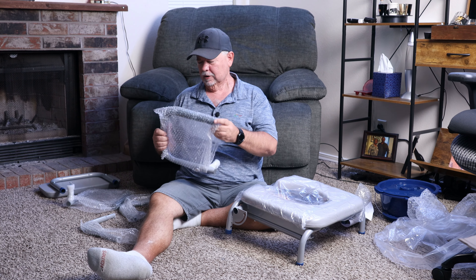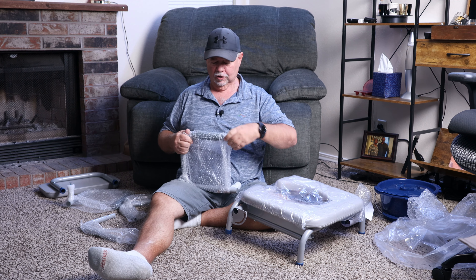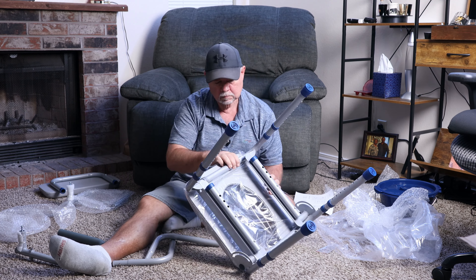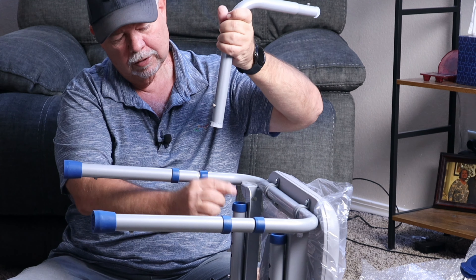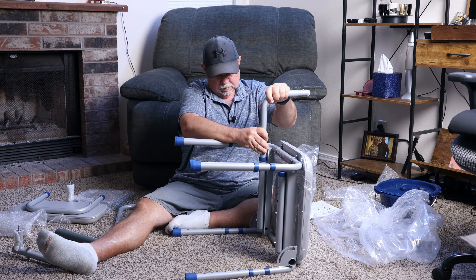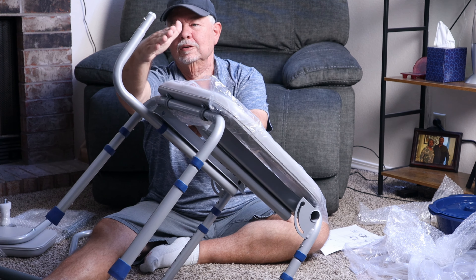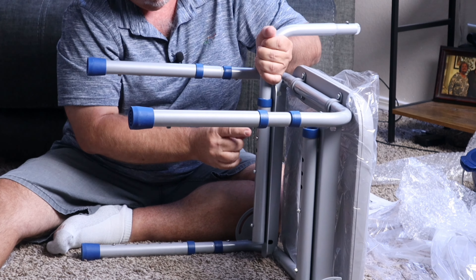Looks like we're going to build the frame. Instructions are not real clear — it's mainly just pictures. So if you're good at following picture instructions, you're going to be in luck. The solid pipe will go into the pipe here, with the smaller end facing up. These are adjustable; you'll have three different levels, which will bring the backrest closer to or further from the seat, whatever you need. We're just going to set it on the middle hole right there.